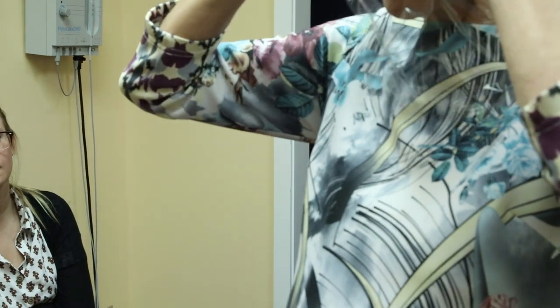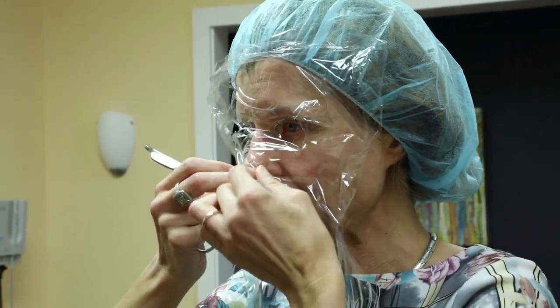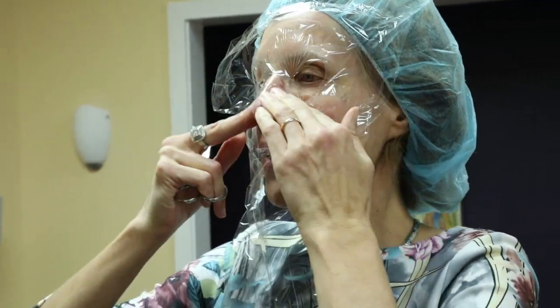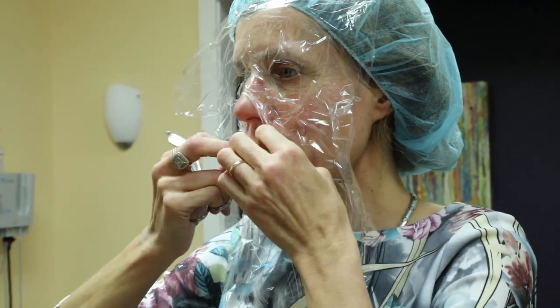You might have to with your fingers adjust a little bit. Then you have to cut something in so that the nose can breathe, but still the nose is going to be well covered and can get treatment. And then you have to do your lips. It's much easier when you don't have to do it on yourself.